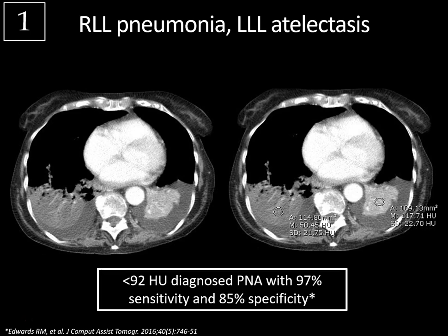In this case, the consolidated lung has a low Hounsfield unit value of 50, that's below 92, whereas the atelectatic lung has a Hounsfield unit density of about 118. This is typically just a visual assessment — you don't usually have to actually measure the density — but it does underscore the importance of how contrast can be quite helpful in differentiating atelectasis from pneumonia.